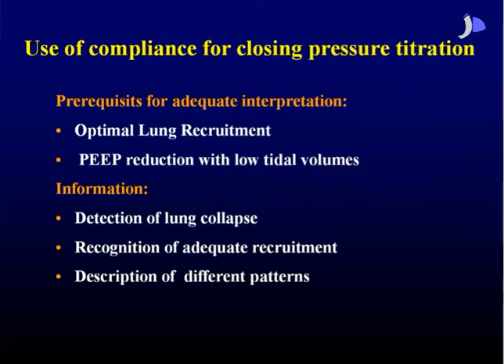We can recognize the adequate recruitment procedure by the behavior of this compliance after recruitment, and we are in the phase of describing different patterns of lung recruitment by looking at other data simultaneously, such as hemodynamics, to see if a specific pattern for a specific group of patients is better than others in terms of tolerance and efficacy.